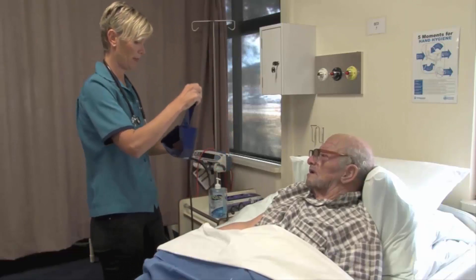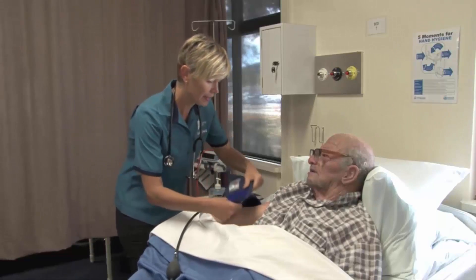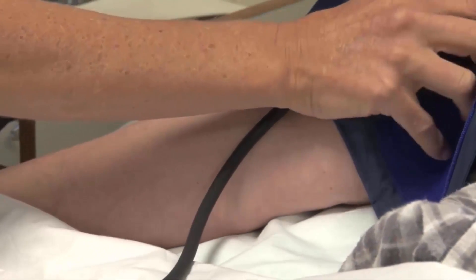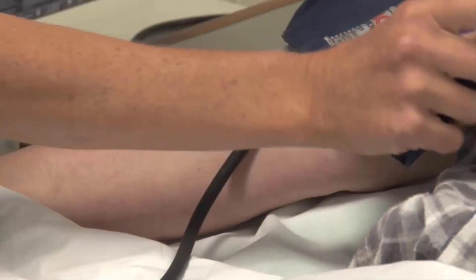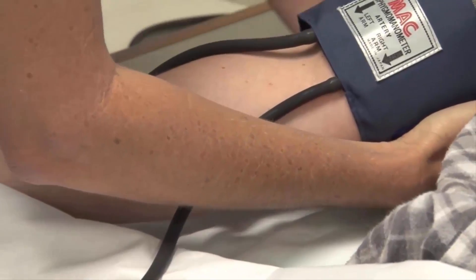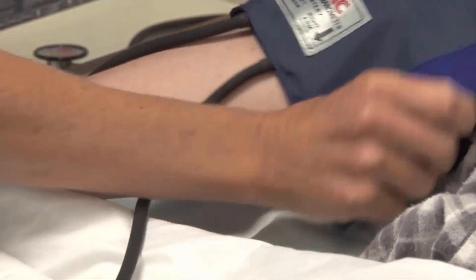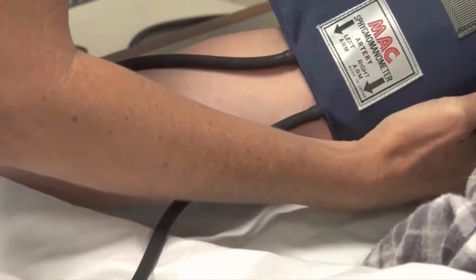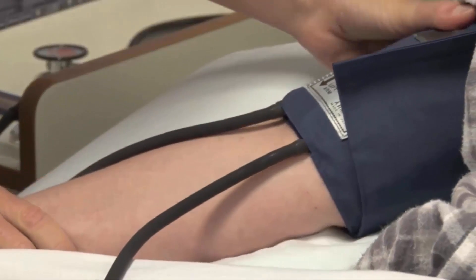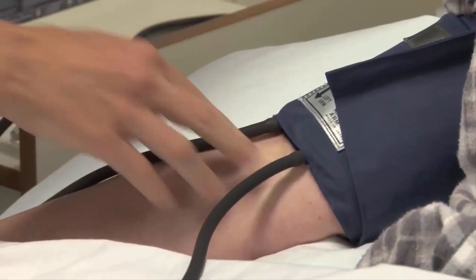I've put the cuff here — it has to be placed two and a half centimeters above the brachial pulse. I'm just going to make sure this is the correct size for you, because that's very important. The cuff should cover around 80% or two-thirds of the arm. If you've got too small a cuff you can get a false high blood pressure, and if you've got too large a cuff you can get a false low blood pressure.